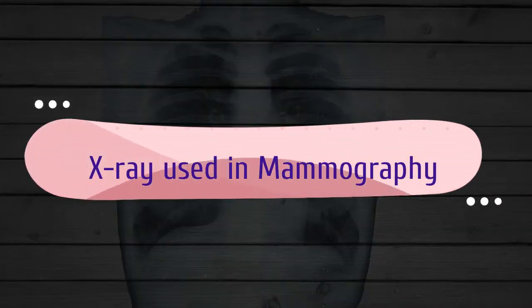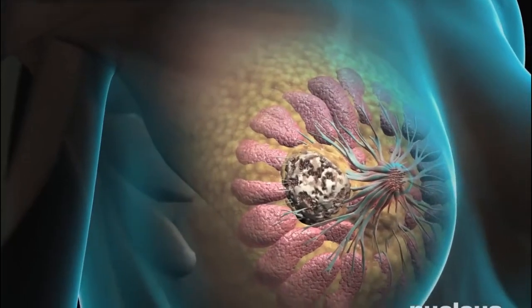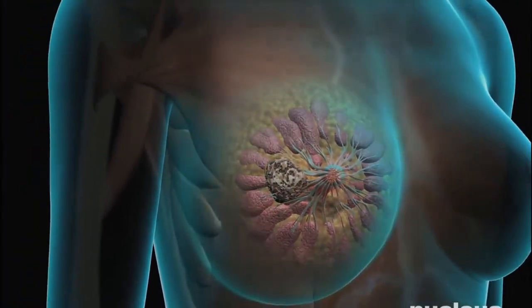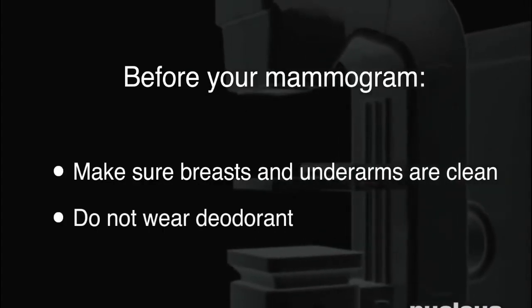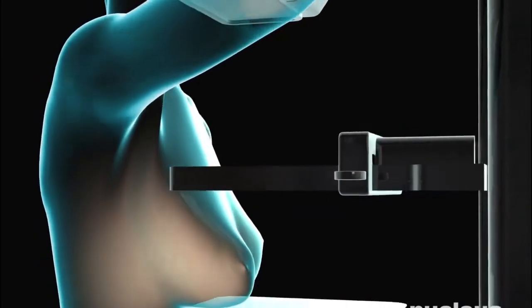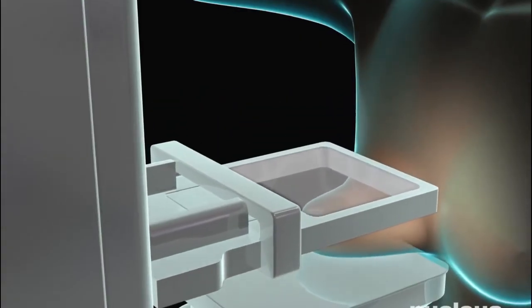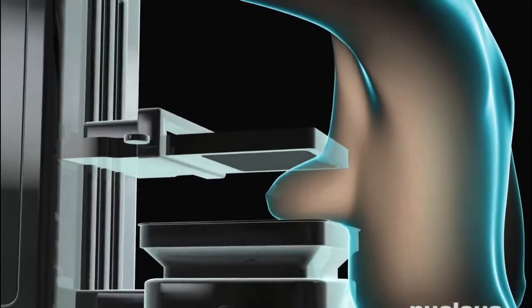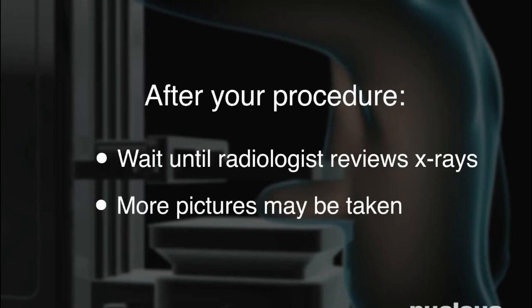Mammography. Most women are familiar with this special X-ray known as a mammogram. It creates detailed images of the breast to be used as a screening tool to detect cancer at an early age or diagnose breast disease from symptoms like pain, a lump, or discharge from the nipple. Tumors will show up as irregular shaped white masses. Today's mammography has advanced to include 3D images that show the entire breast. This new technology helps to increase the likelihood of early detection of breast cancers.